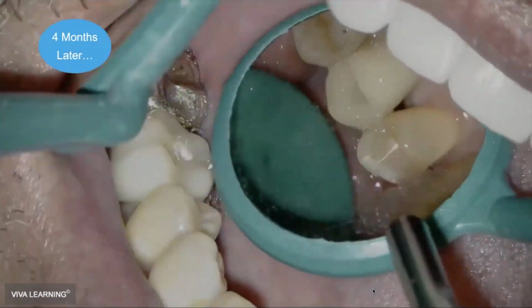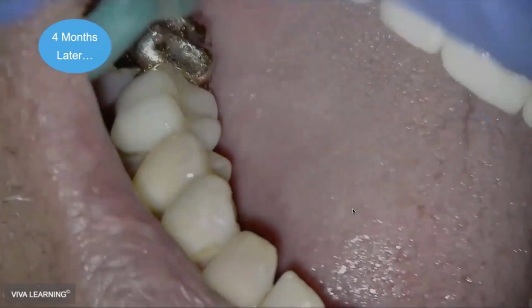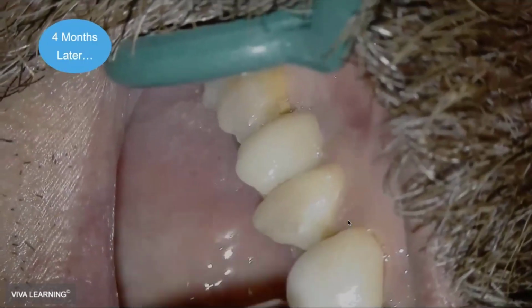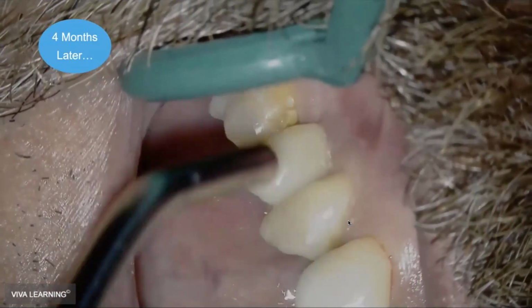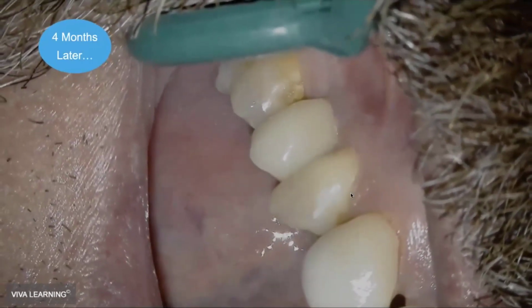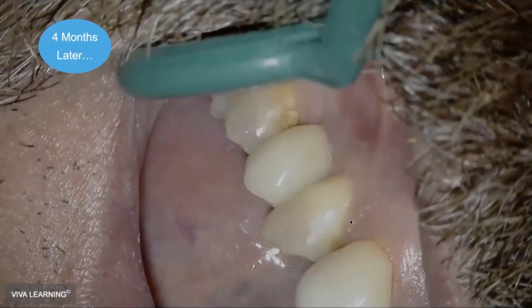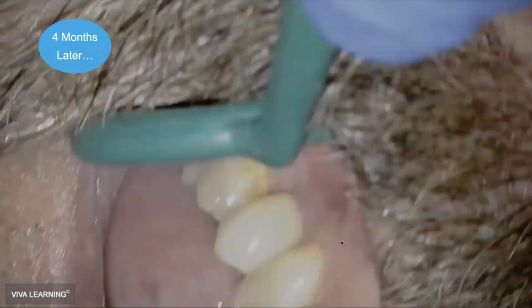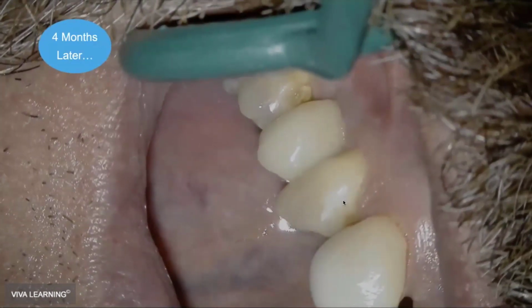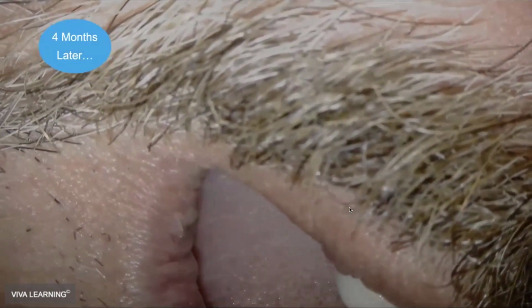And of course, this is most likely a general dentist that placed this implant because it goes right through the middle. I've had some complicated situations recently from my specialists, which I need to have conversations with them about, because it's put me in some very difficult, almost impossible restorative situations. But when you have a crown that's digitally planned and it goes right through the middle, it's a restorative slam dunk.